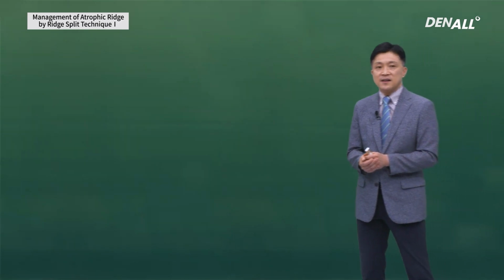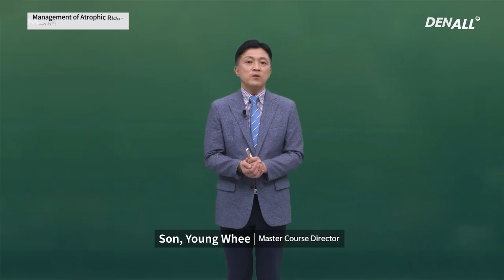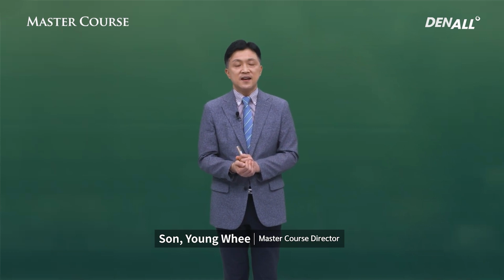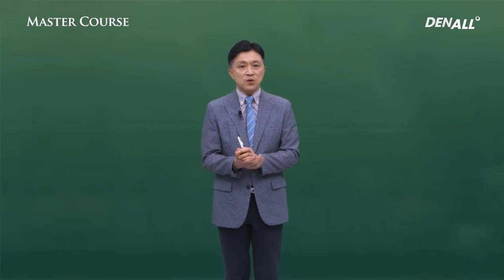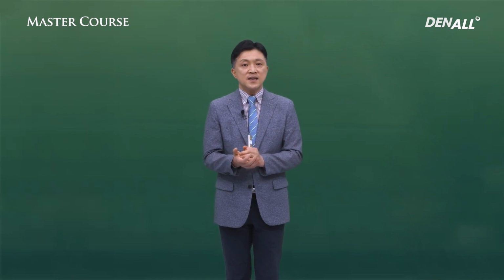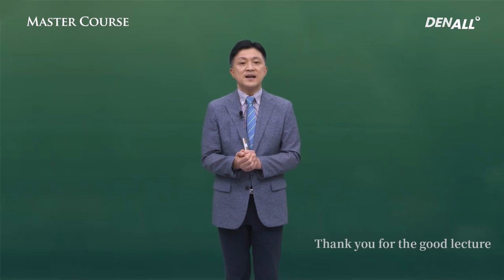I'm going to close off now. The asset kit can be used to do safe ridge split when there's a lack of horizontal bone amount. You can place implants safely in narrow ridges. I hope you use this kit to improve your skills and expand your know-how.